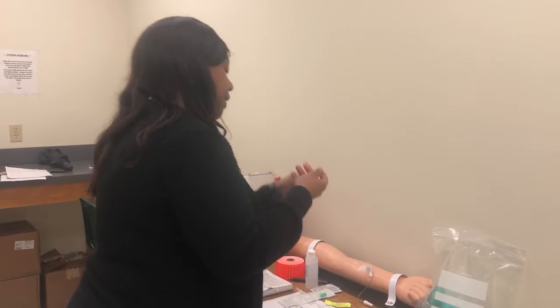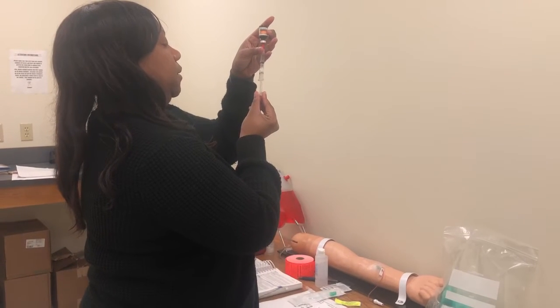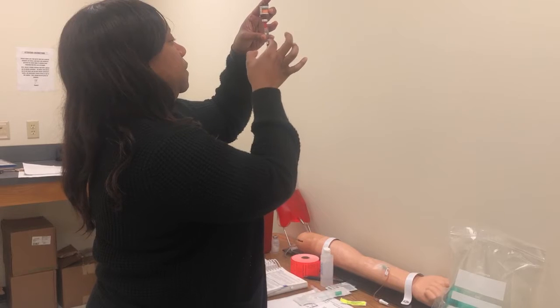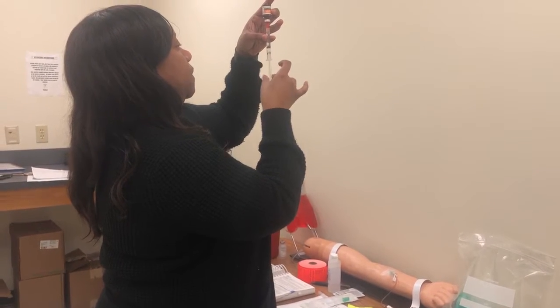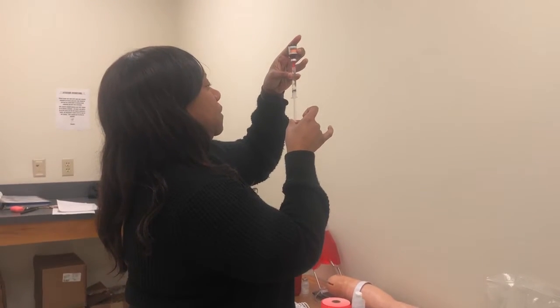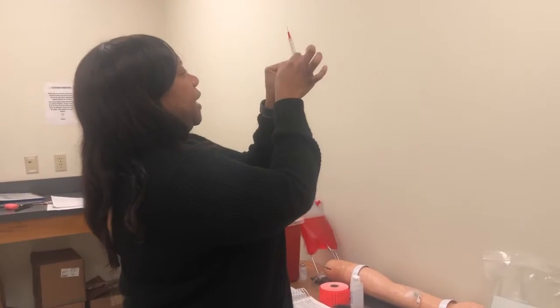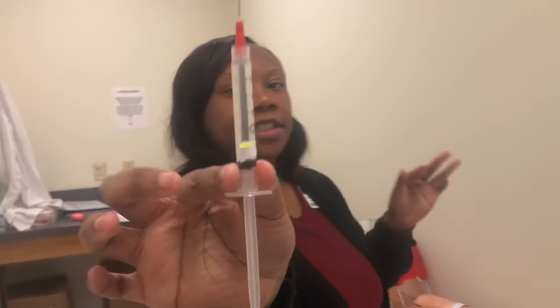Push my air in. Okay, I'll be inspecting to make sure I don't have any air bubbles. I do not. 3 milliliters.